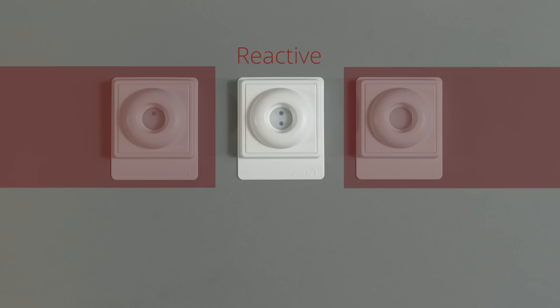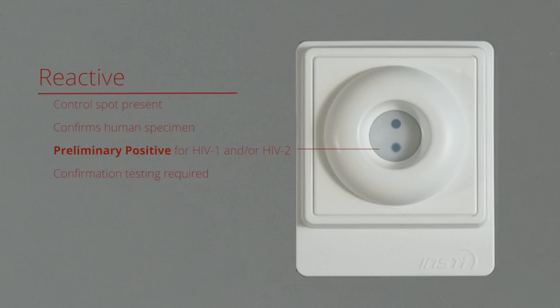Reactive result: two blue spots. One control spot and one test spot that are discernible above any background tint indicates that the specimen contains HIV-1 and/or HIV-2 antibodies. Following a reactive test result, HIV confirmation testing should be conducted.